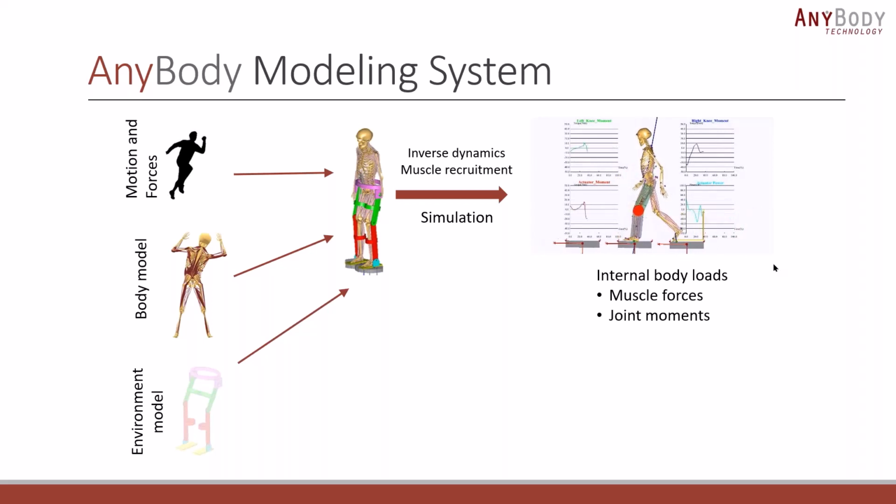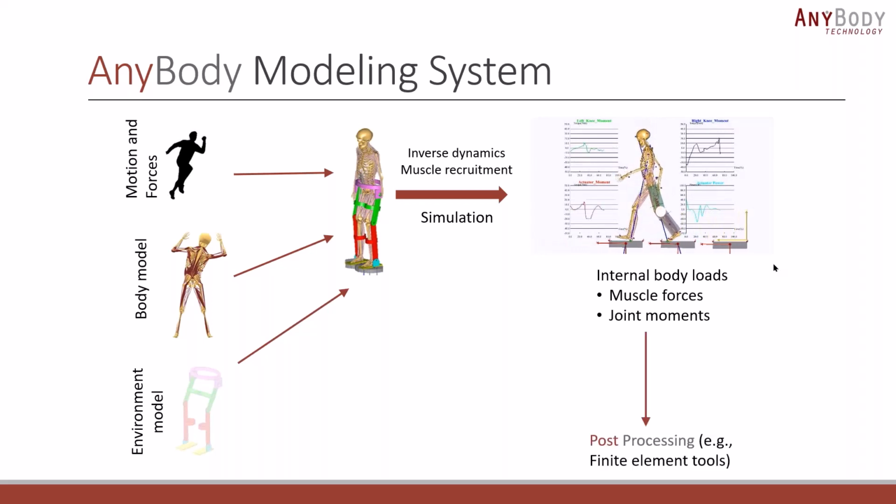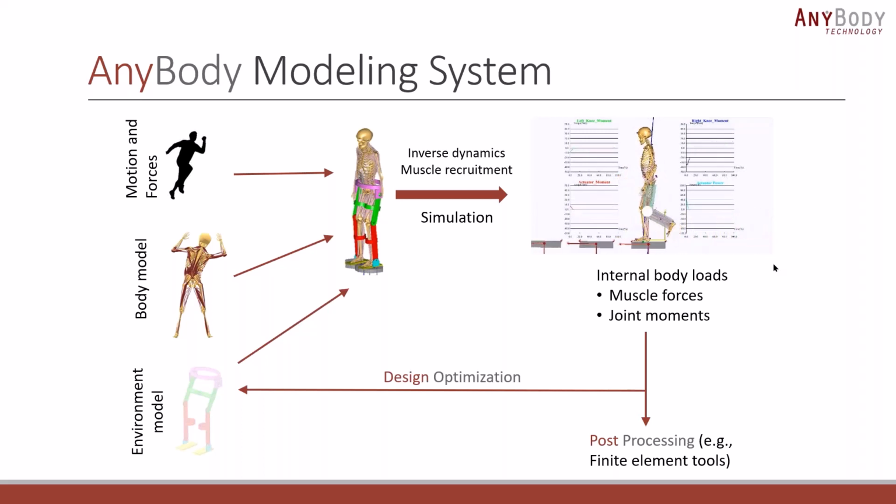We can then output the results and use them for some kind of post-processing, which for example could be with a finite element tool. But many users also choose to complete this loop and do some kind of design optimization and then run this cycle multiple times.